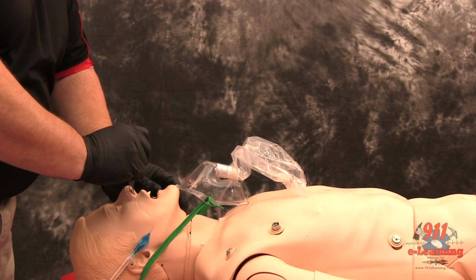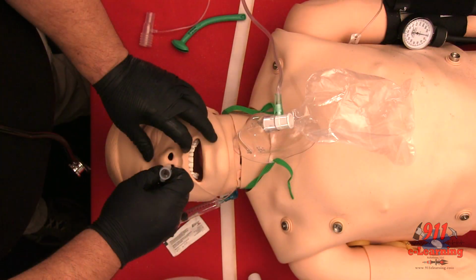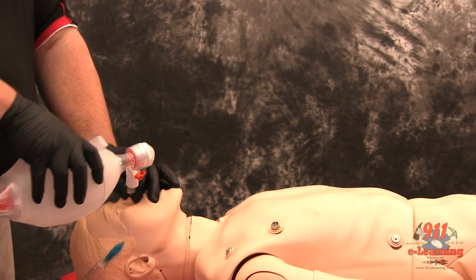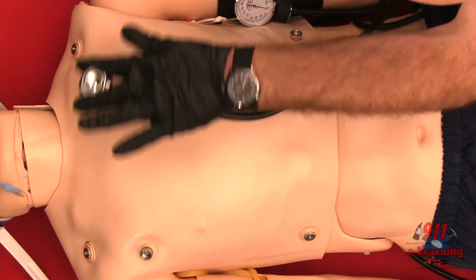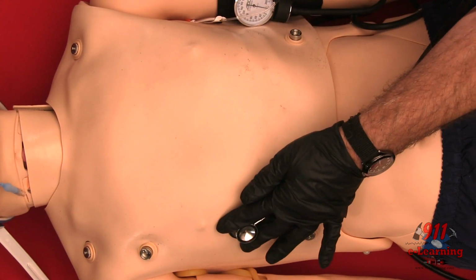Upon entering the trachea, the tube may cause the patient to cough, buck, strain, or gag. Do not remove the tube. This is normal, but be prepared to control the cervical spine and the patient, and be alert for vomiting. Auscultate for bilaterally equal breath sounds and absence of sounds of the epigastrium. Observe for symmetrical chest expansion.